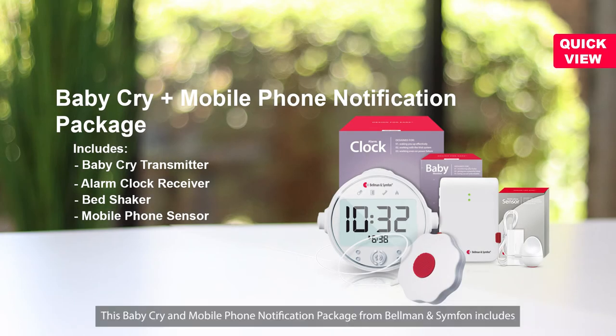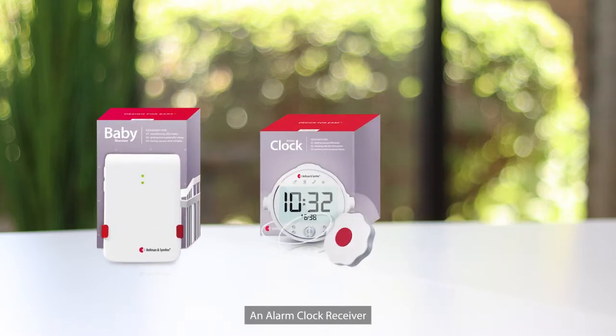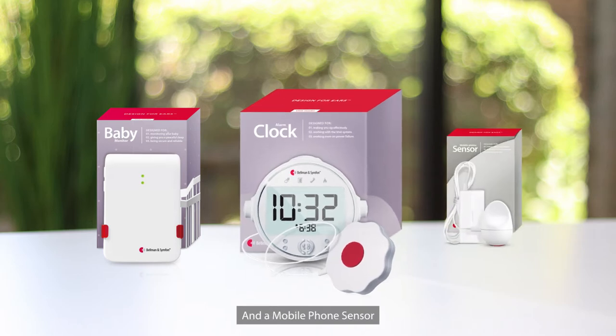This baby cry and mobile phone notification package from Bellman & Symfon includes a baby cry transmitter, an alarm clock receiver, a bed shaker, and a mobile phone sensor.